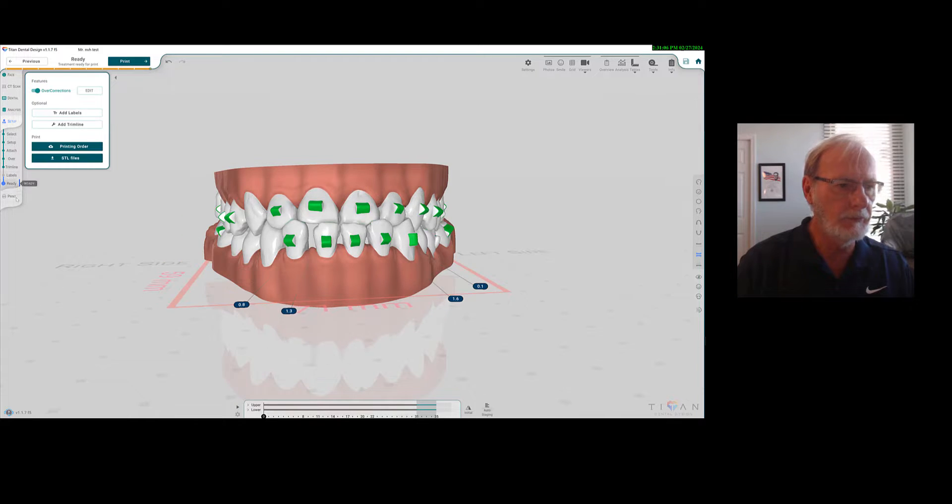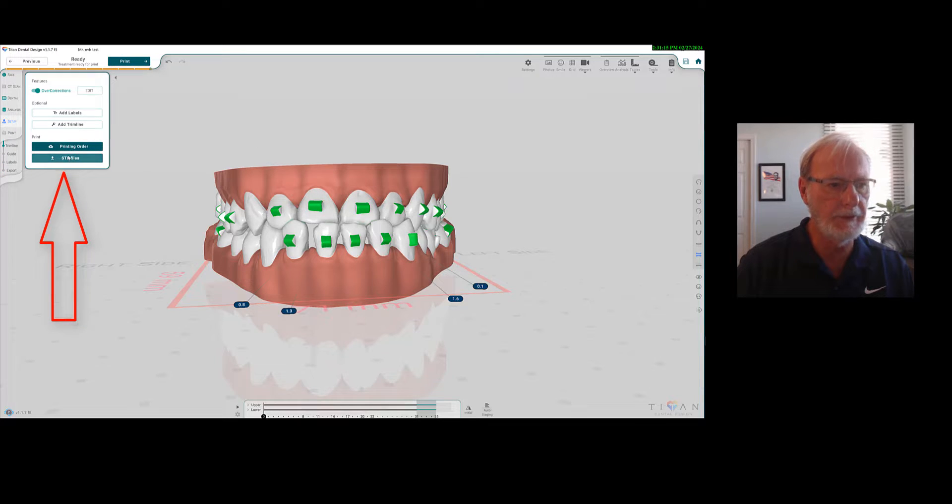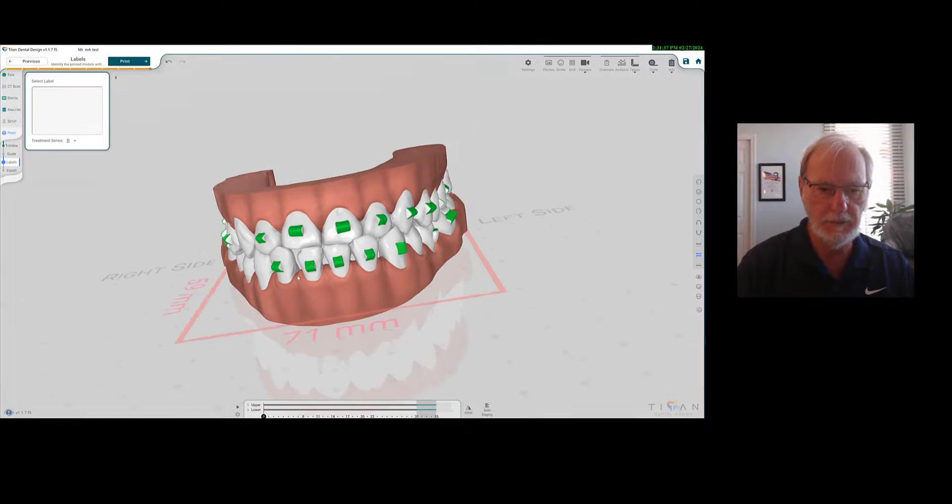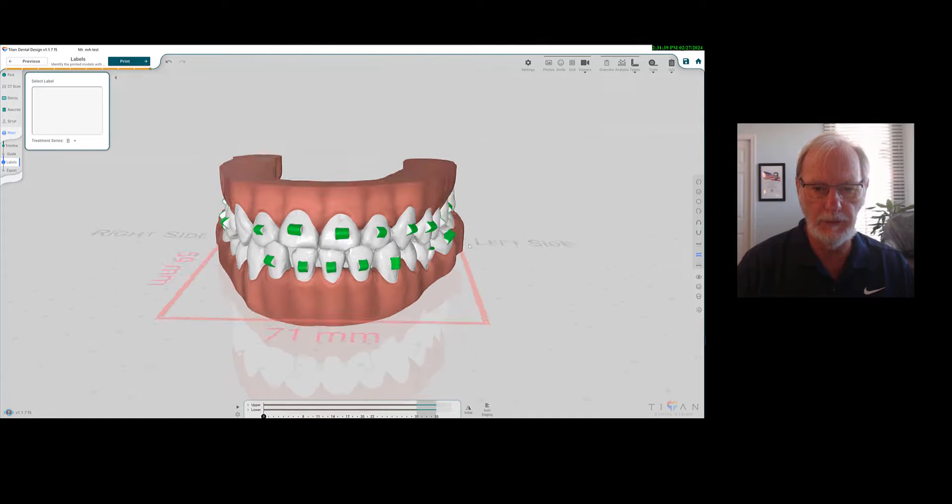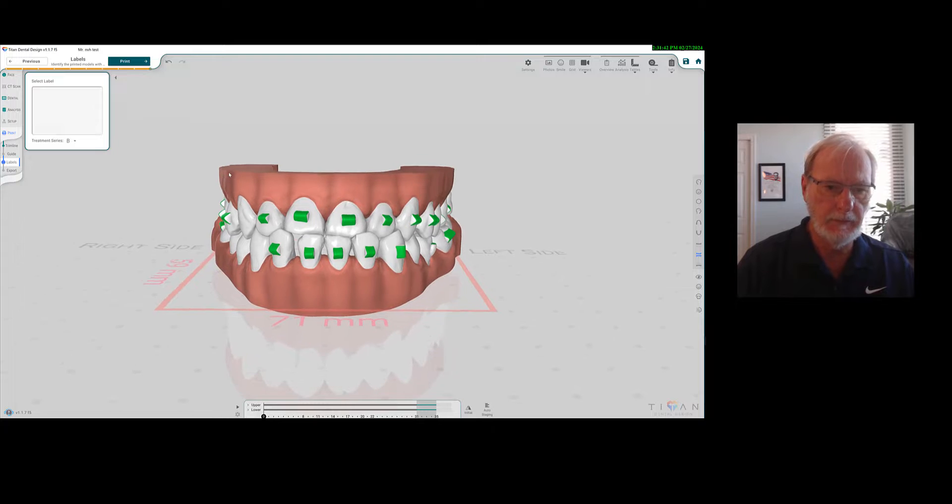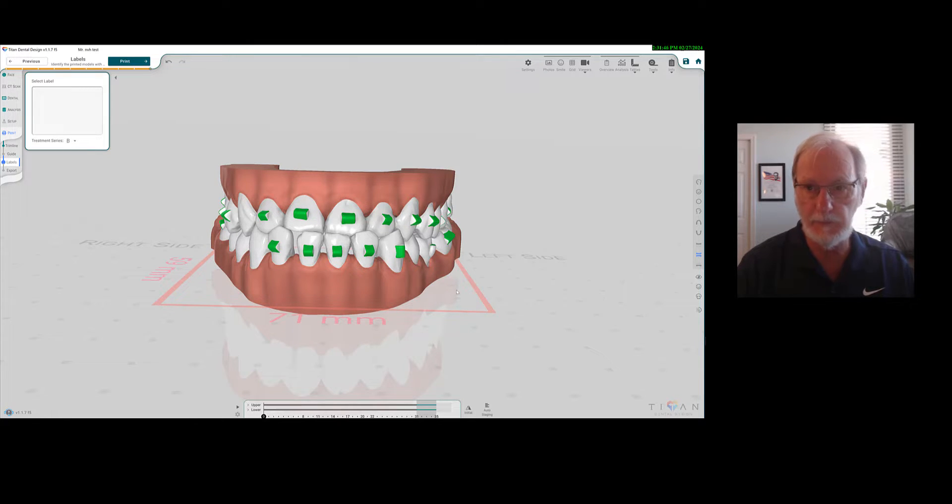Then I'm ready to print, and that's it. You can do a printing order, or you can export your STL files. I like the, I really do like the Titan. I got two problems that I'd like maybe to be addressed, and maybe I missed them.